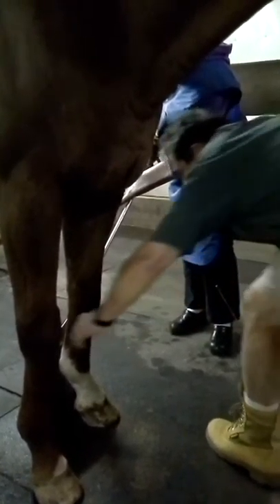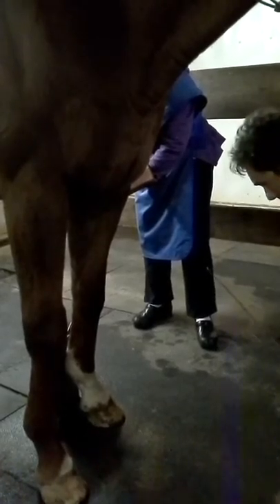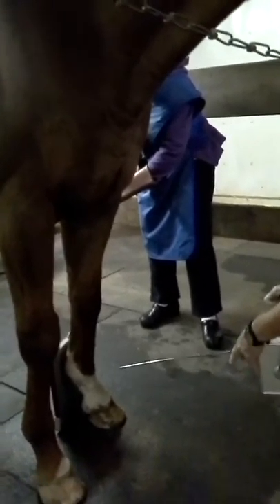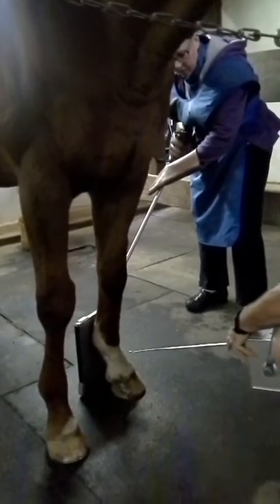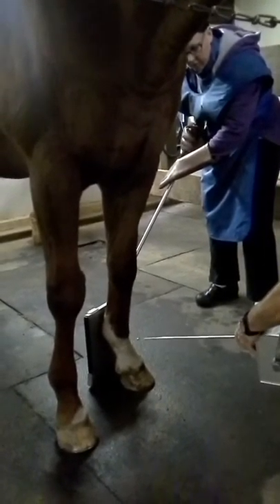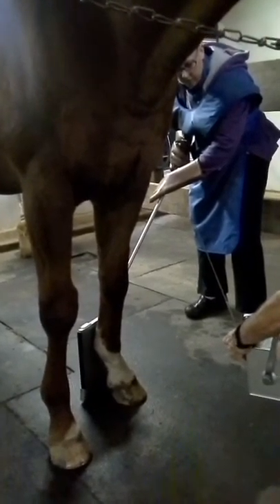You're going to be completely perpendicular right here. You want to move this over here like this. This is what's called an AP view. This is your pointer, which will tell you the direction of the beam. You remove this when you take it and click. That's your first view — the AP view.